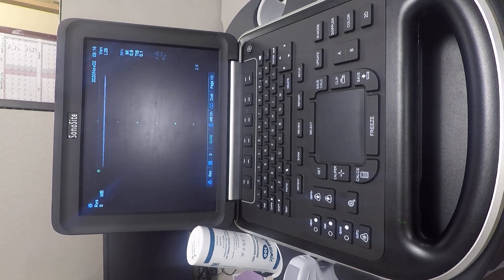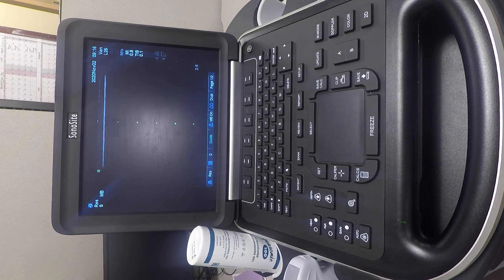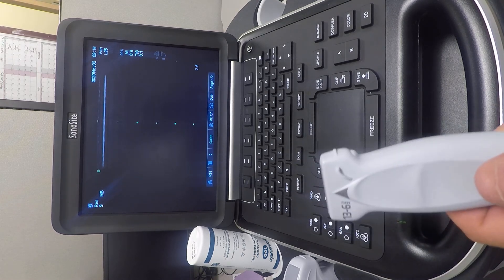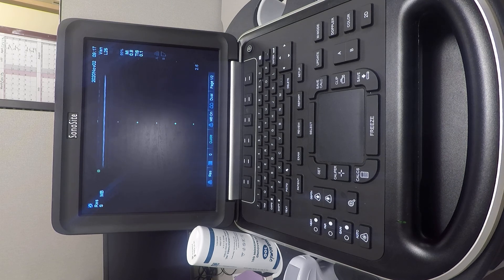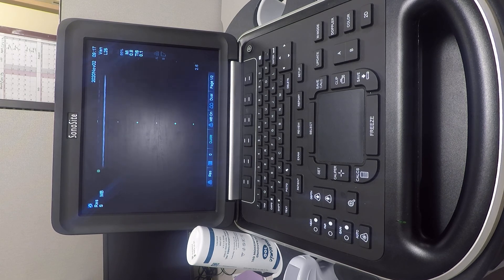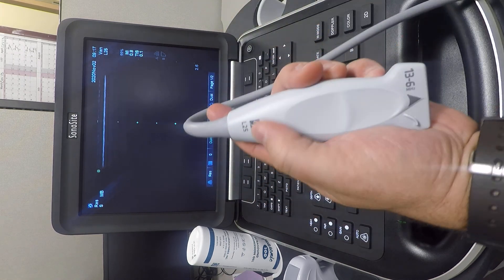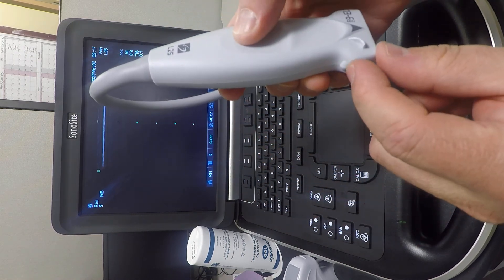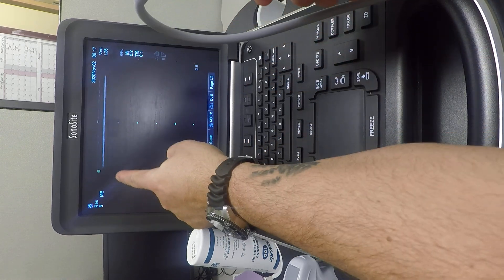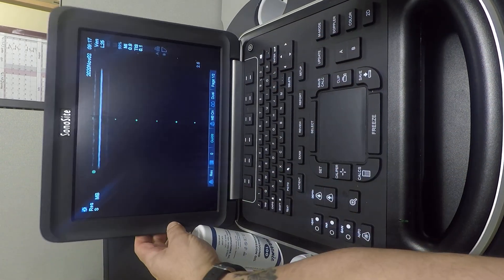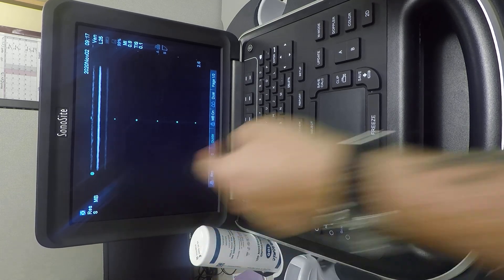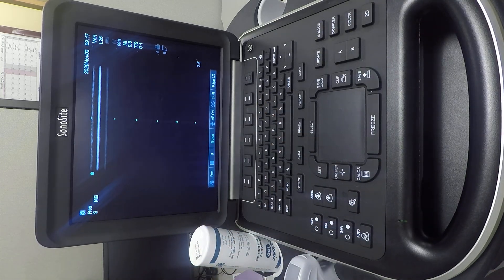Alright, step one: do not drop the probe. We'll do an anatomic overview and how to get what you're trying to look at. Lots of jelly — the probe position bump up here corresponds to the green dot up there on screen. Let's dive in.